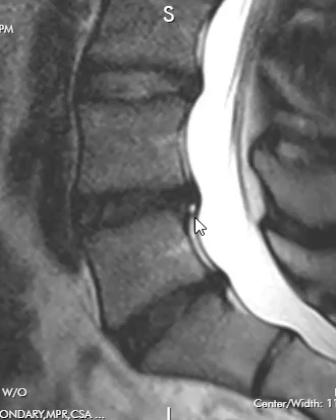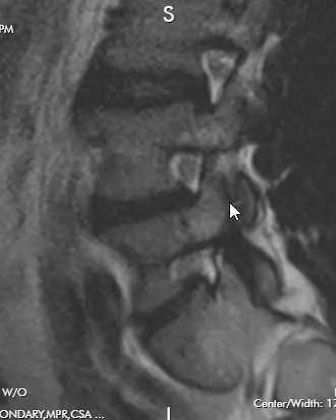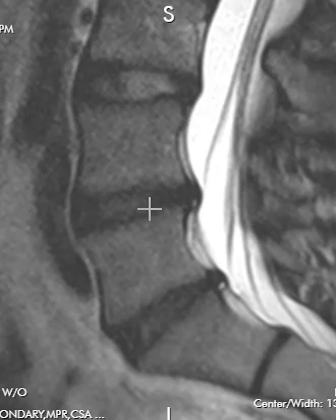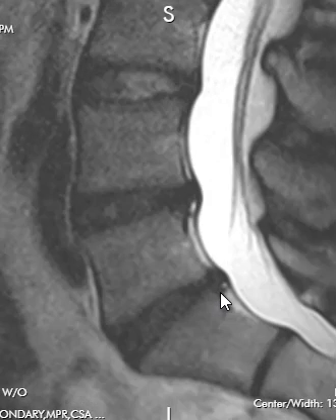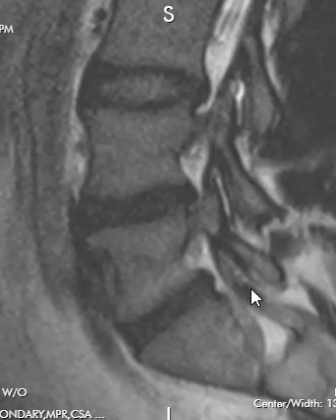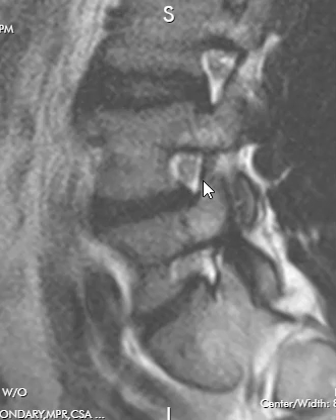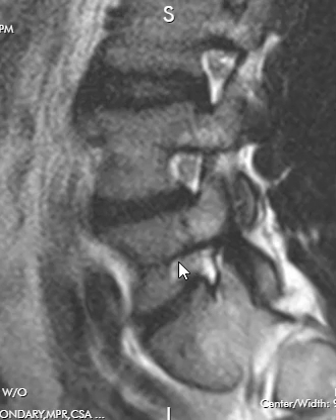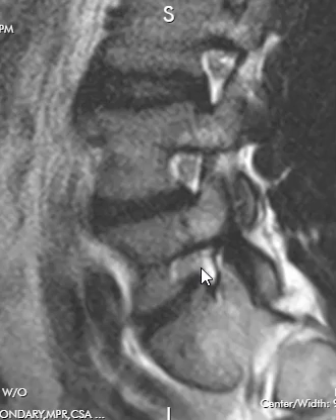The disc protrusion has an annular fissure, but the disc material has not spilled out and the spinal canal is nicely wide open. Rolling to the right, the foramina look pretty good. At the bottom level L5-S1 there's a broad central protruding disc. Rolling to the left, however, we see that the nerve is getting pushed on — it's not round anymore. This one over here is round with fat around it and room to pass through, but this one looks like it's being compressed by a bony spur and disc material. I call this moderate narrowing of the left foramen, pushing on the nerve that goes down to the left lower leg or foot.